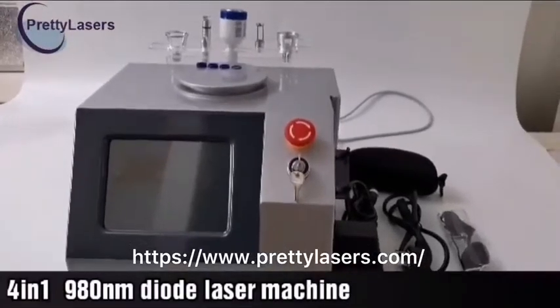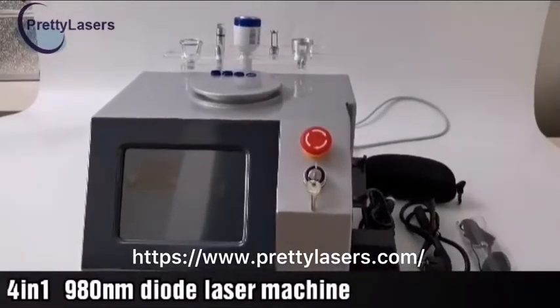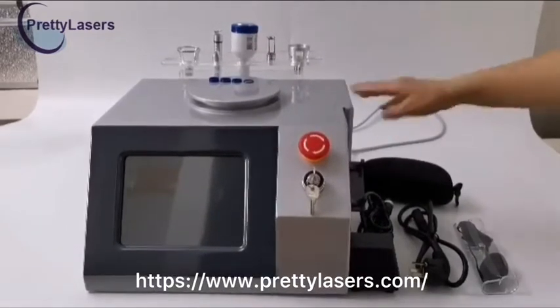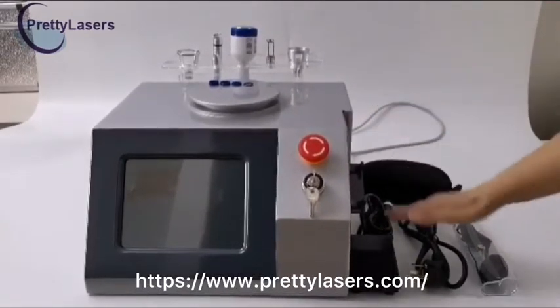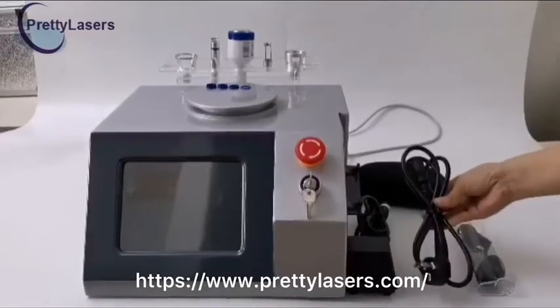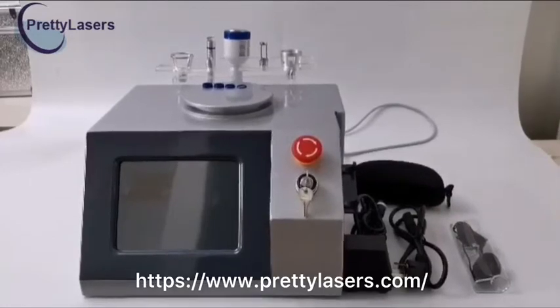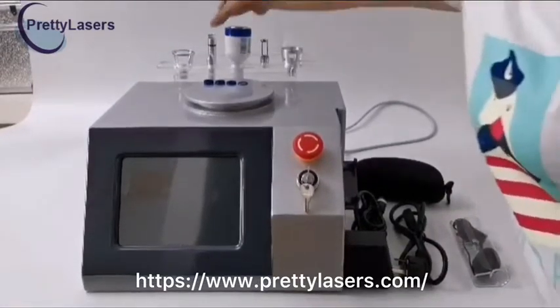Now let's introduce the 4-in-1 980nm Diode Laser Machine. This is the main engine. This is the power switch. This is the power cord, 110V to 220V universal. This is the fiber optic handle.